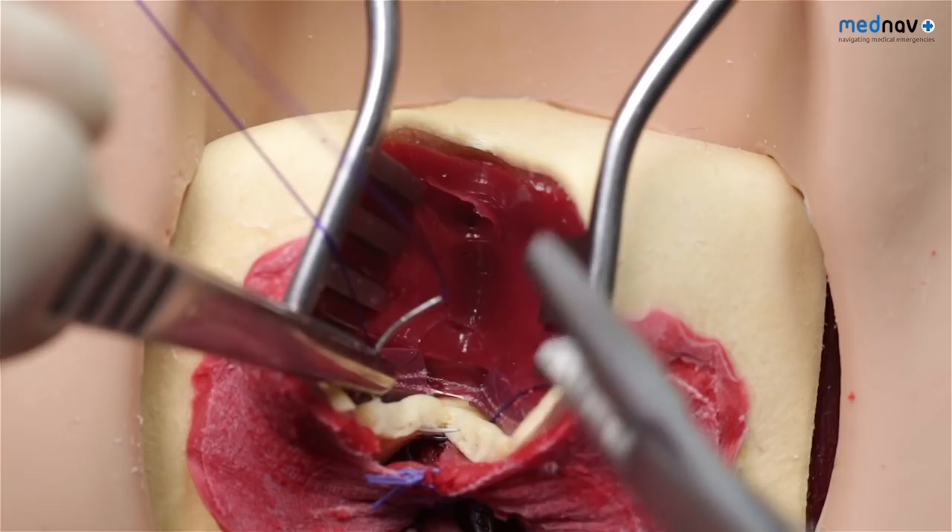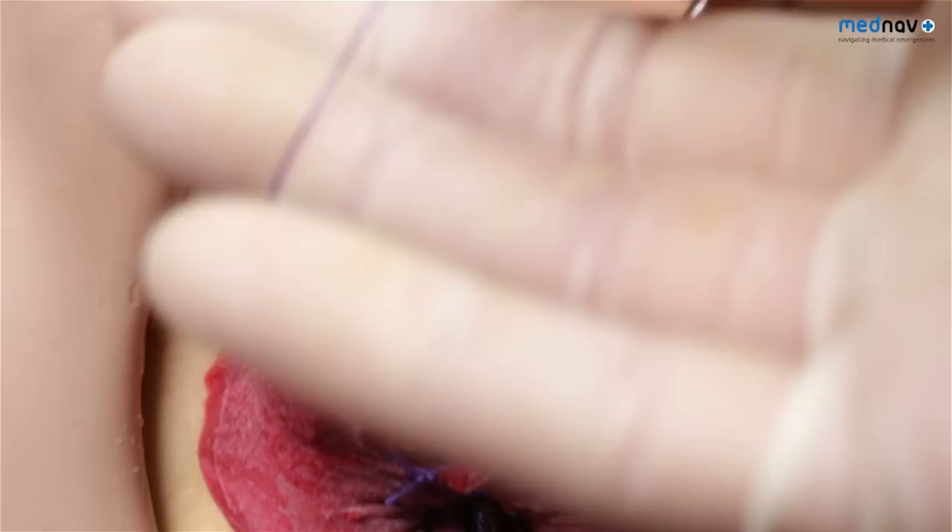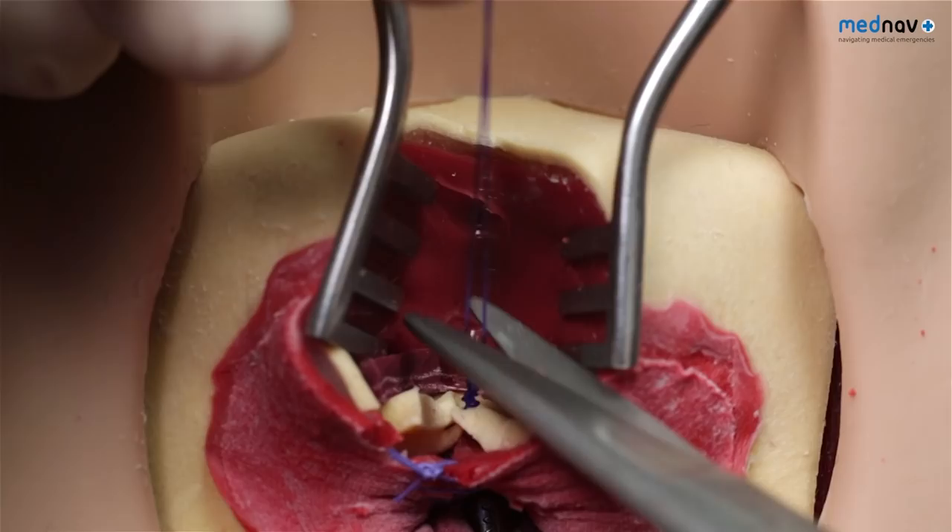Now reverse your needle, taking a full thickness bite from the same side and through to the side you started from. Tie off this stitch. This end-to-end mattress suture technique is used along the length of the internal anal sphincter.